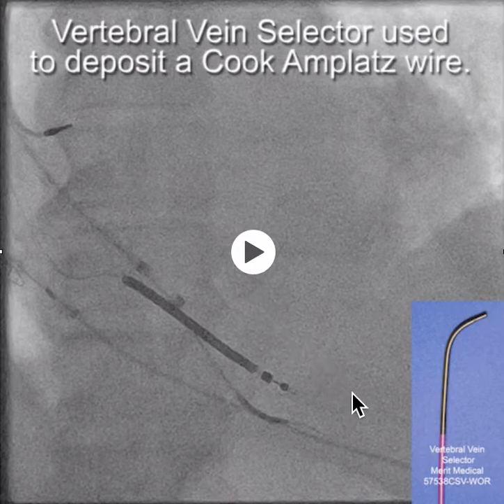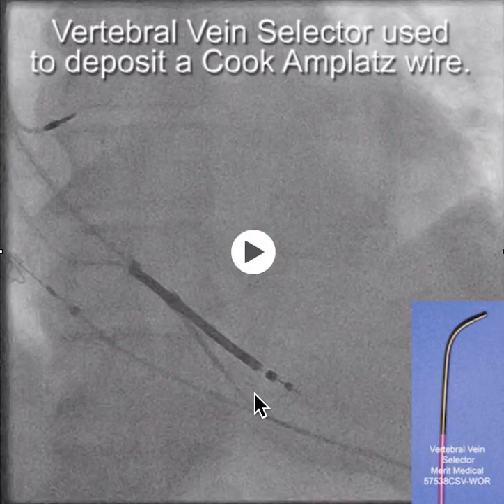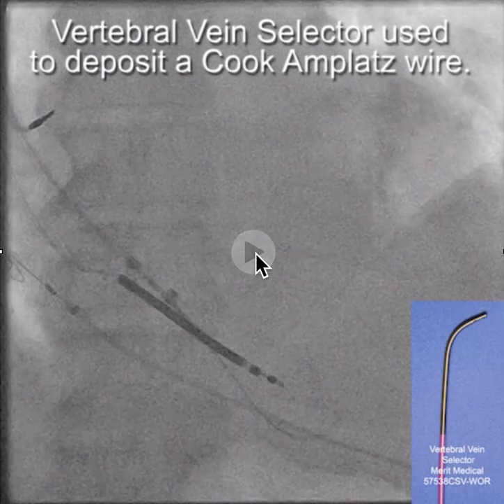To do this, we use the vertebral vein selector, advanced that down into the coronary sinus over a glide wire, took the glide wire out, and then through the vein selector we deposited the Cook Amplatz wire. It's important to use a Cook Amplatz wire because it's the only one with a J-tip that has a short taper — otherwise you don't really have any wire support. Also notice that the vein selector fits through the braided core of the Worley sheath.